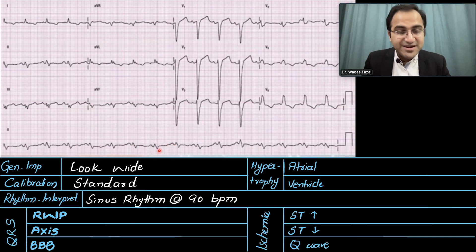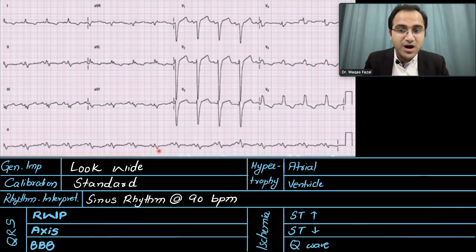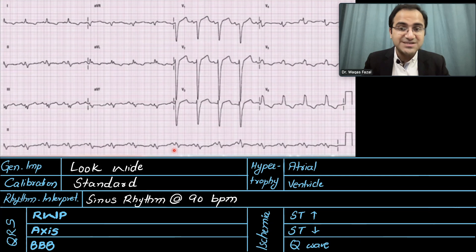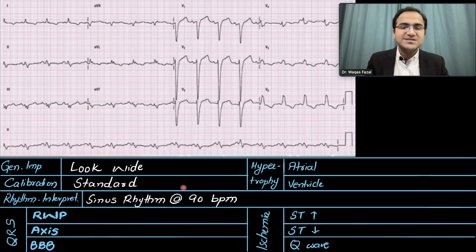Now let us calculate the heart rate by counting the number of large boxes between the R waves. Between the two R waves there are 3 large boxes. One large box equals 300 beats per minute, two large boxes is 150, and three large boxes is 100 — and it is slightly more than that, so it is 90 to 100 beats per minute. Sinus rhythm at the rate of 90 beats per minute.